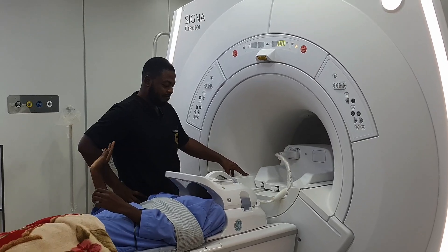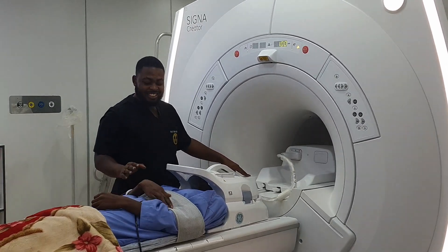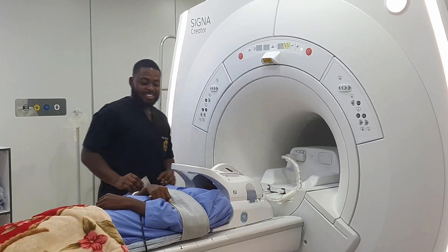Oh my god, I feel scared. Can you release my hand? Just release my hand.